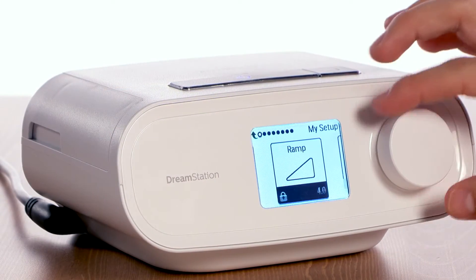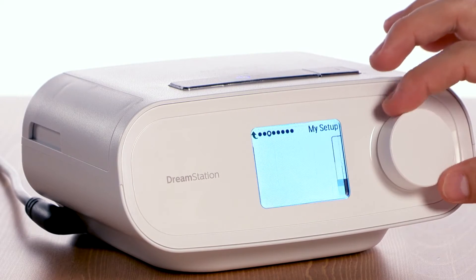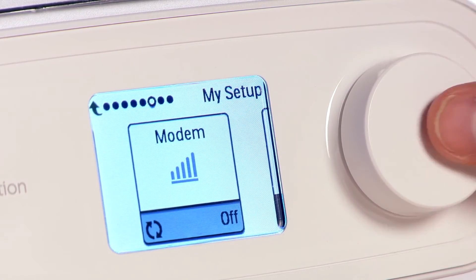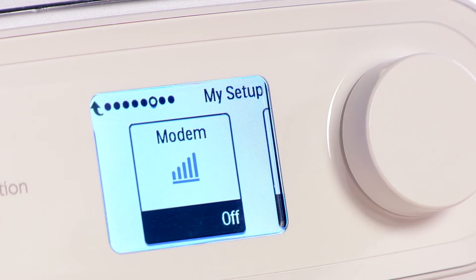In the My Setup menu, there is a screen that allows you to turn the modem off temporarily. This may be helpful when you want the device to stop transmitting, such as in an aircraft or in the hospital. The modem will automatically turn back on in three days.